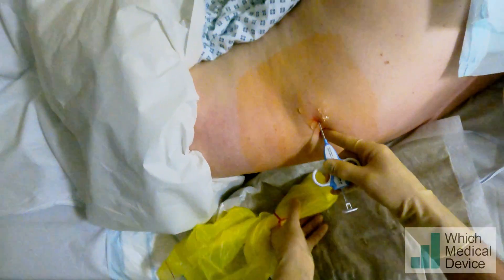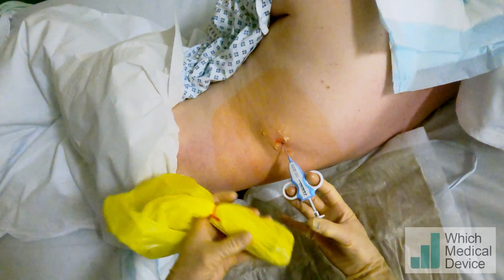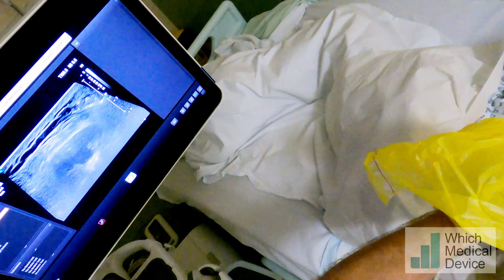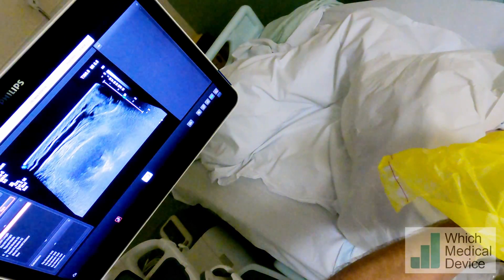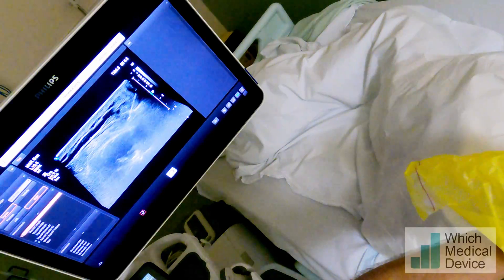So we'll just pop that through the skin. I'm going to put my hand into the position to control it, then going to place our ultrasound on and we're going to see the path of our needle once we get into the view. That's it there. Is that okay?